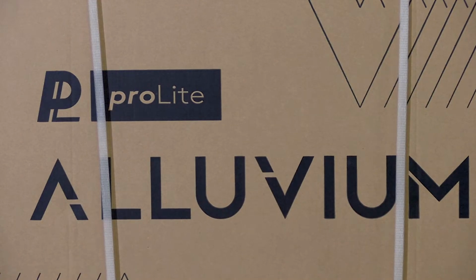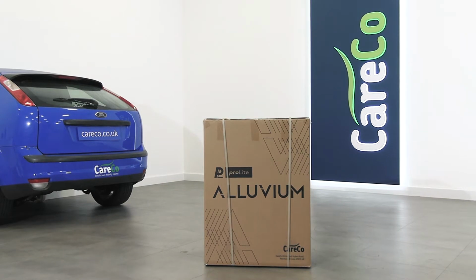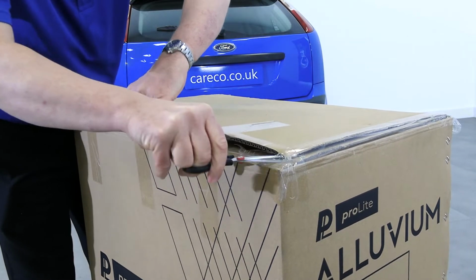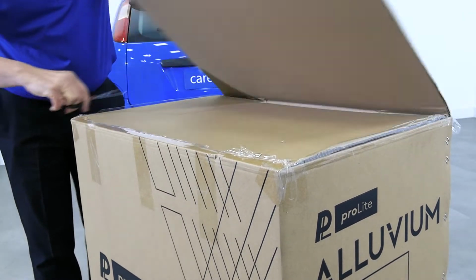Your Alluvium power chair should come fully boxed as seen here. Courier delivery is available straight to your doorstep. Carefully cut any tape with a knife or a pair of scissors to open the box. Please take care to avoid scratching the frame or any of the cables inside.